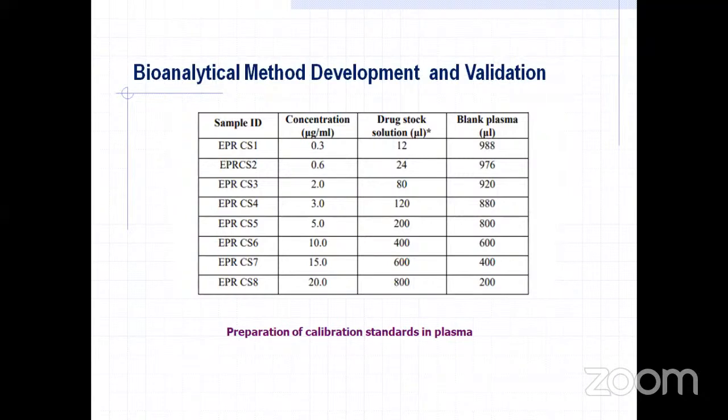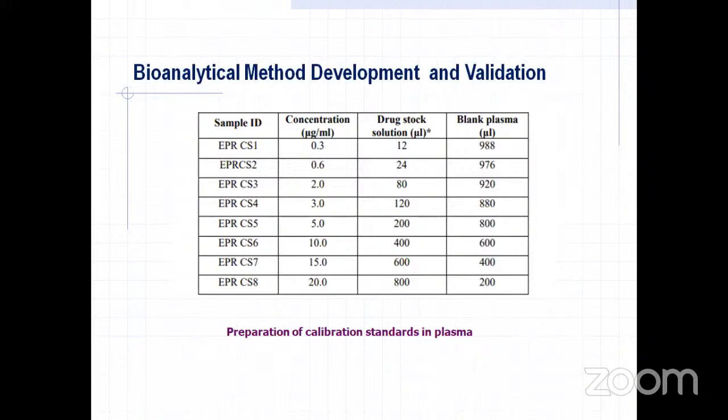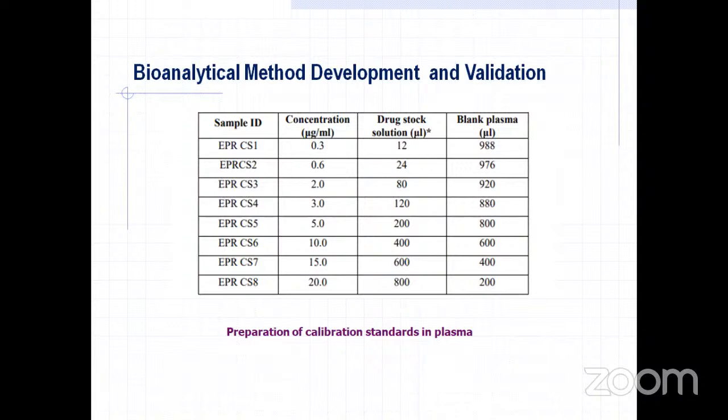What about the internal standard, sir? Internal standard, I have used 50 microliters, constant. That is the maximum; you should not go beyond 50. So you can start from 2 microliters to 50 microliters, at any concentration.